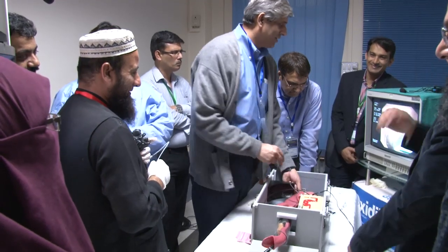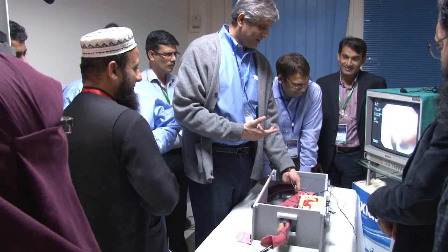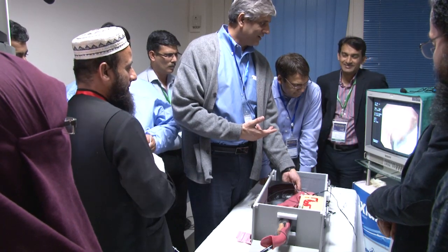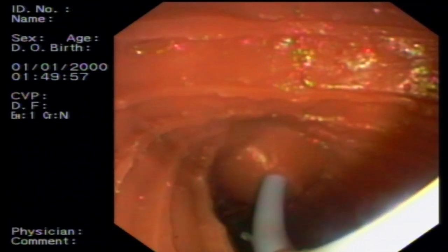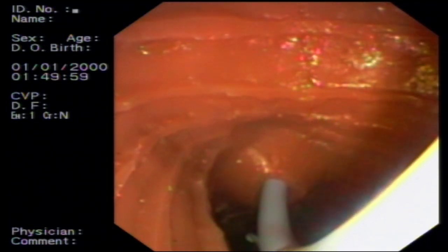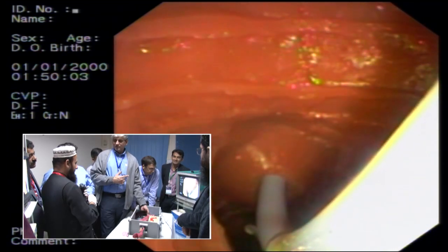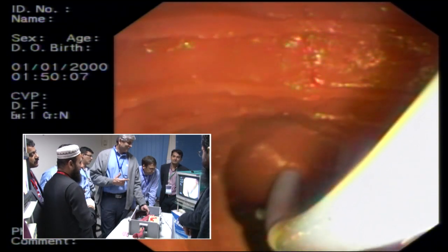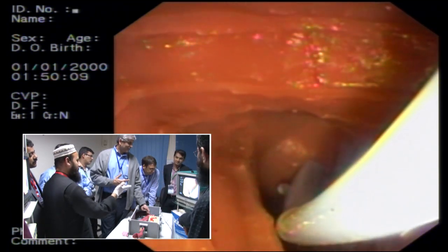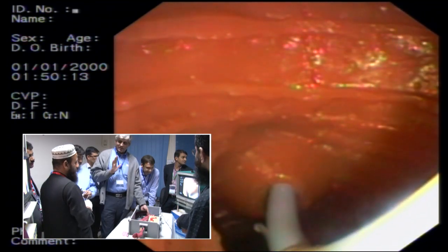This is almost as good as it's going to be. ठीक है ना? So you need to just keep going. You're doing well. That's done. Okay. Now what do you do? Flanges के बाद, then I would tell him to take everything out. Where you were. Are you happy with the position there? Not really. Why not? I mean, I'm not too pushed about it, but yeah, but fine. That's okay. That's reasonable position for me. That's fine. Your stent is in position.